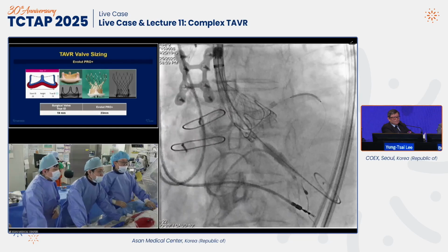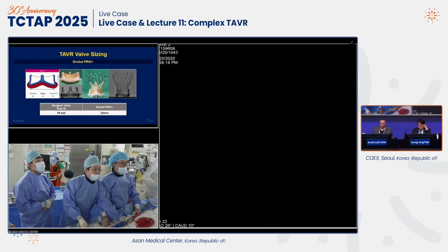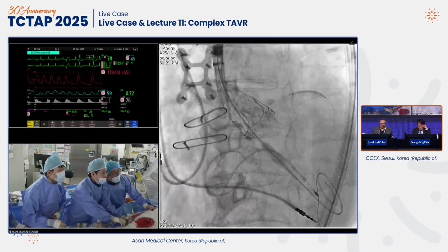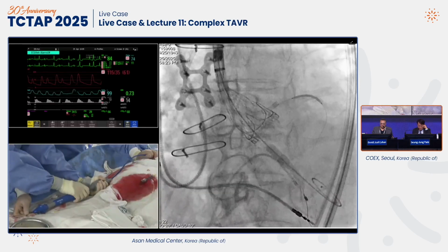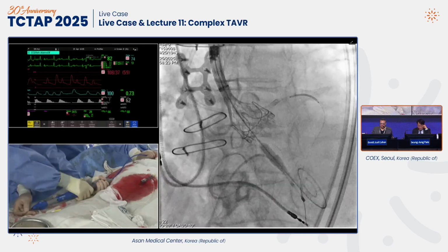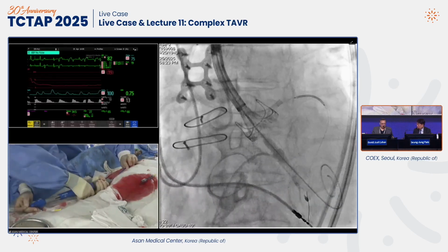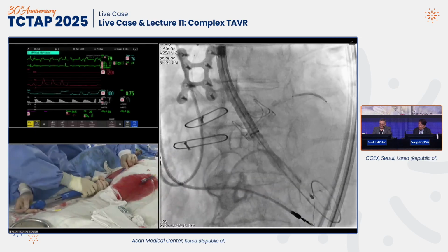I think you can probably get it down just a tiny bit lower. Yeah. Okay. It's reassuring that you have good coronary flow. Okay, we're going to deploy. Okay, good. 2 millimeters more. Okay, we try 2.5. Okay, great. Okay. Good. That's great.